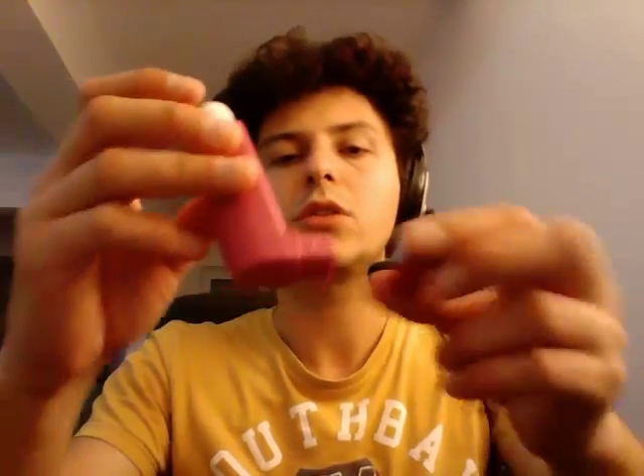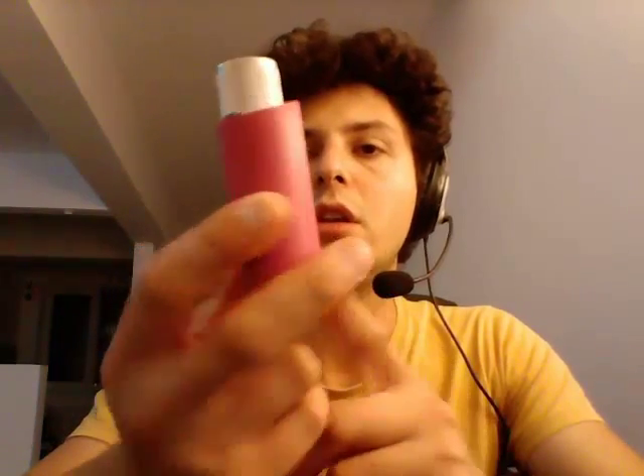So this is the new device. It's called Foster. It's an asthma drug, and it looks just like a relief medication, like Ventolin, Albuterol, something of this nature. It comes in a box like this, Foster, as you can see.